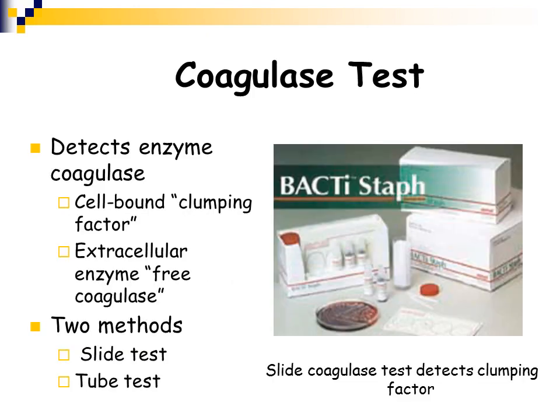There are many different types of commercial coagulase tests available. Many labs are using various tests. Again, Catalase and Coagulase are 2 of the manual tests that are actually still performed in a clinical laboratory. So Coagulase is going to detect the enzyme coagulase, and there are 2 different methods that are commonly used.